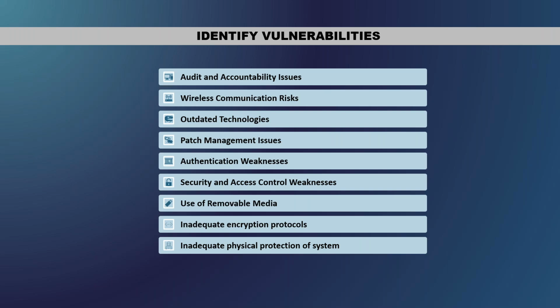And then you have certain medical devices designed using older technology, such as older software versions or firmware. Additionally, these devices might not have been designed with security as a key consideration if they were older. Then patch management issues. So the inability to update or install security patches in certain medical devices could prevent software defects from being addressed. And then authentication weaknesses.